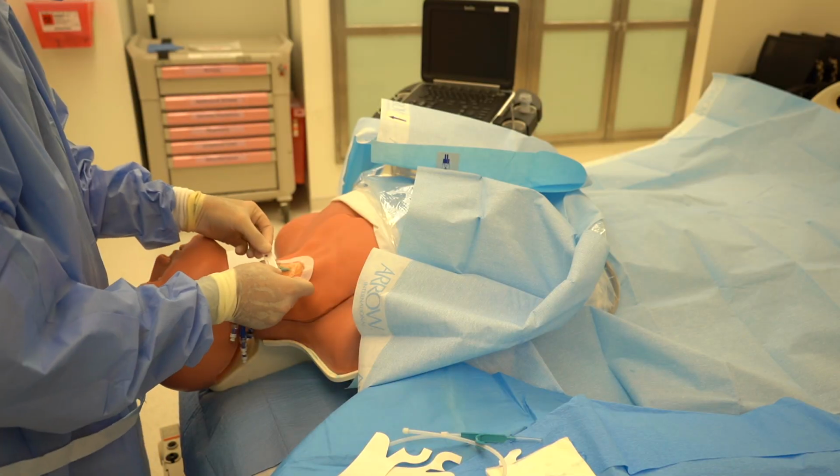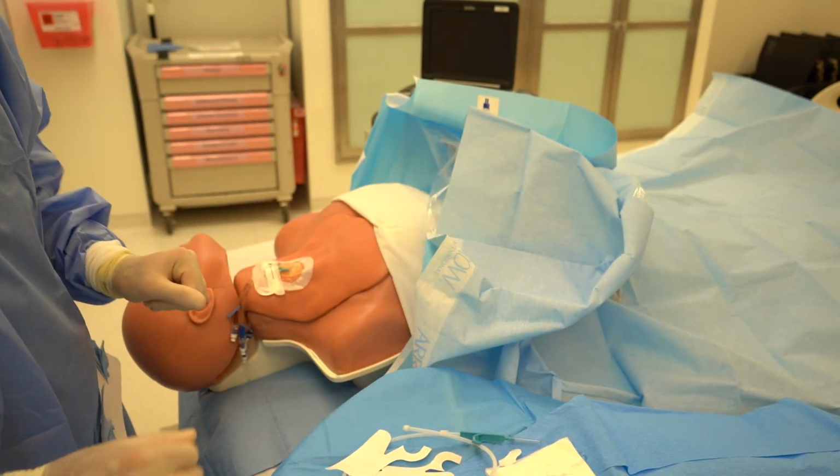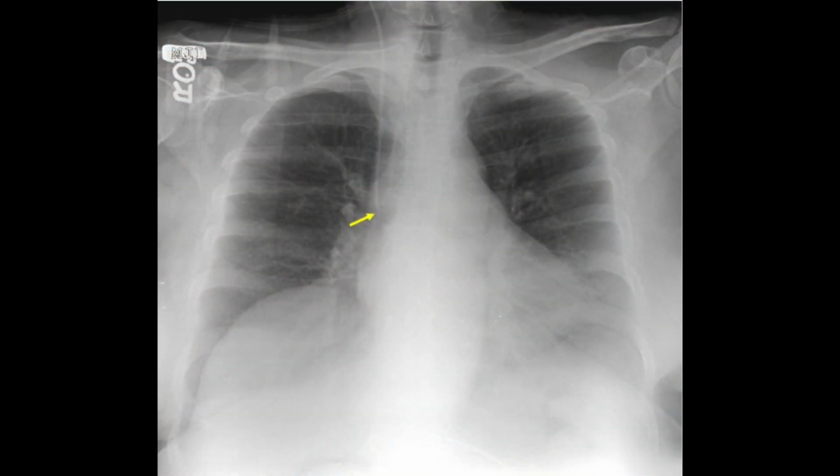We'll order our level 1 chest x-ray while we're documenting our note. We'll review our chest x-ray for potential complications and for appropriate placement of our central line. In this case, since there's an internal jugular approach, we would like to have the catheter at the cavoatrial junction.